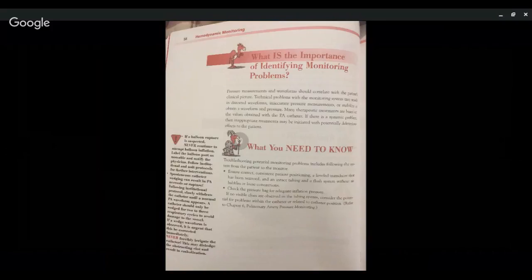Never forcibly irrigate the catheter. This may dislodge the obstructing clot and result in embolization. There are 3 potential system problems that may be encountered with a pulmonary artery monitoring system: inability to obtain wedge pressures, dampened pulmonary artery waveforms, or no waveforms at all.